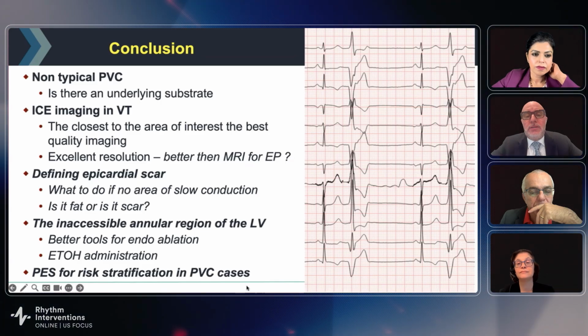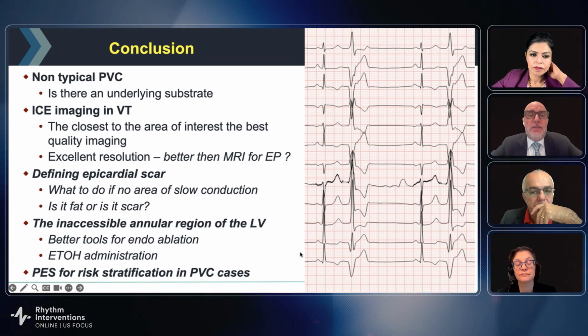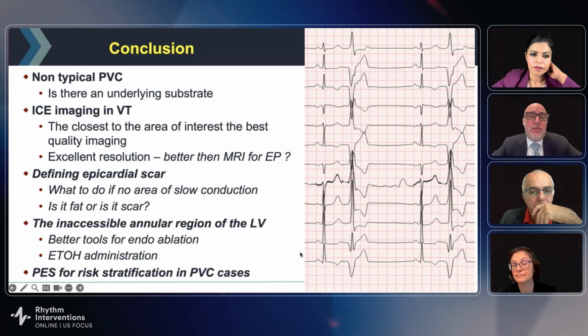And I always consider, in patients with PVC that are non-typical and you question what's going on, programmed stimulation for risk stratification is still an important tool.